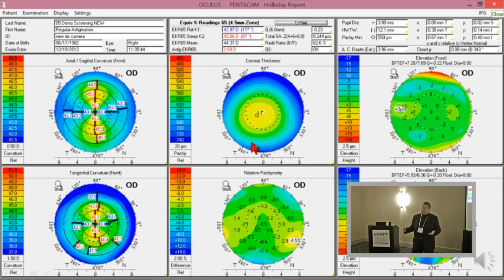All you have to do is say, gee, which of those 3 is closer to the positive value in the patient? And the answer is plus 0.244 is closest to minus 0.27. So in this patient, you're going to end up with almost 0 when you choose a minus 0.27 lens. And it's always best to have it 0 or slightly negative. Now, there's a lot of confusion about that. People say, well, gee, a little positive spherical aberration gives you depth of field.